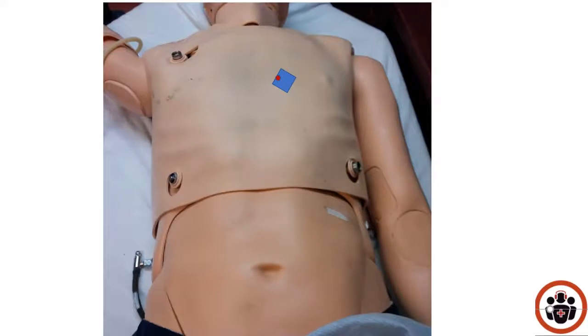In order to do the parasternal long scan, we're going to place the probe with the marker angled towards the patient's right shoulder and the beam pointing straight through into the patient's back. We place the probe, as the name suggests, right beside the sternum. The parasternal long view will be right beside the sternum at the level of the nipple line, more or less.